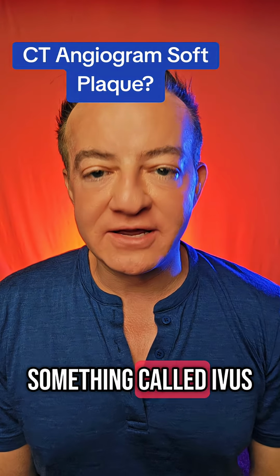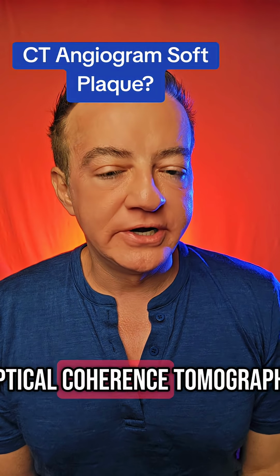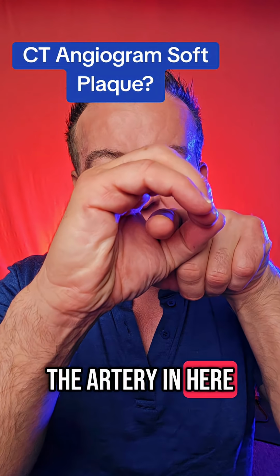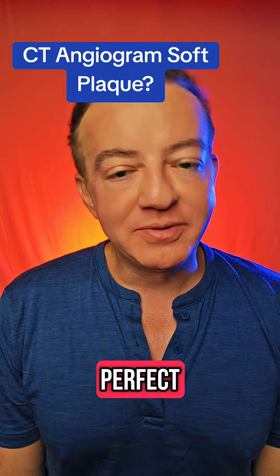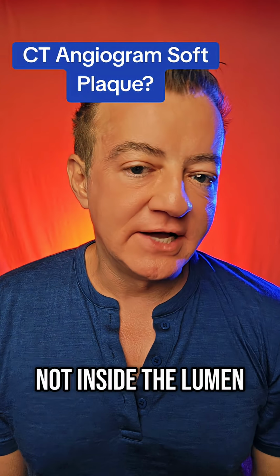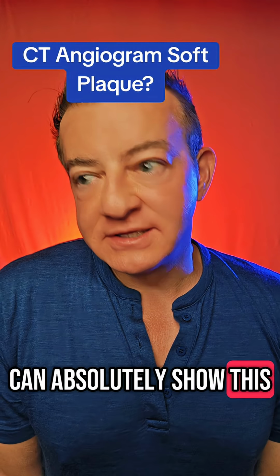Well, they have something called IVUS, intravascular ultrasound. They have something called OCT, optical coherence tomography. We put a catheter down into the artery in here, and we take ultrasound or optical pictures of the arterial wall. Now, it's not perfect, but it's pretty good. And you actually are looking inside the wall and not inside the lumen. So if you're wondering how we can absolutely show this, this would be how.